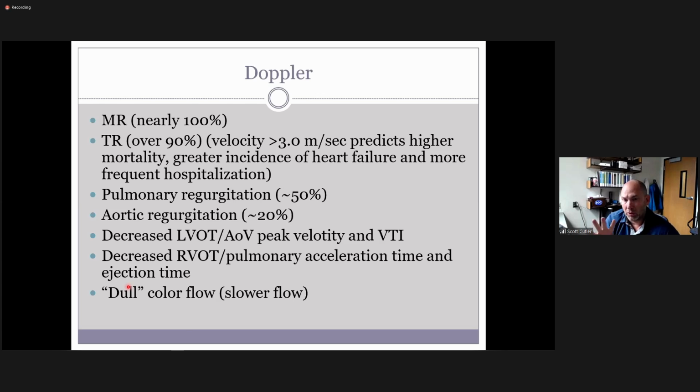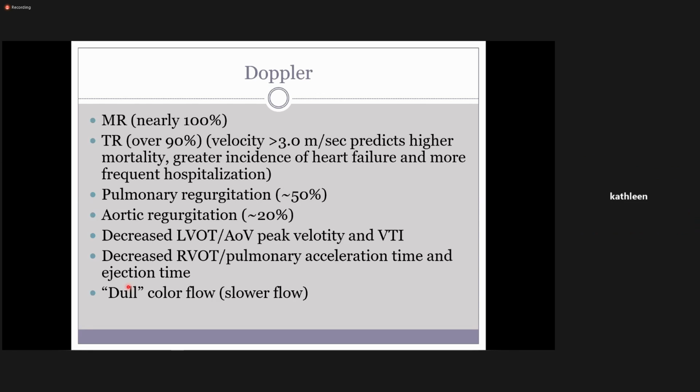Like I want you to know from a dilated cardiomyopathy standpoint, what pictures are the most meaningful in this particular pathology. Yes, we're going to look at walls, and we'll look at walls with hypertrophic cardiomyopathy as well, but we're looking at different things. Okay, so then which views are the most important for this?